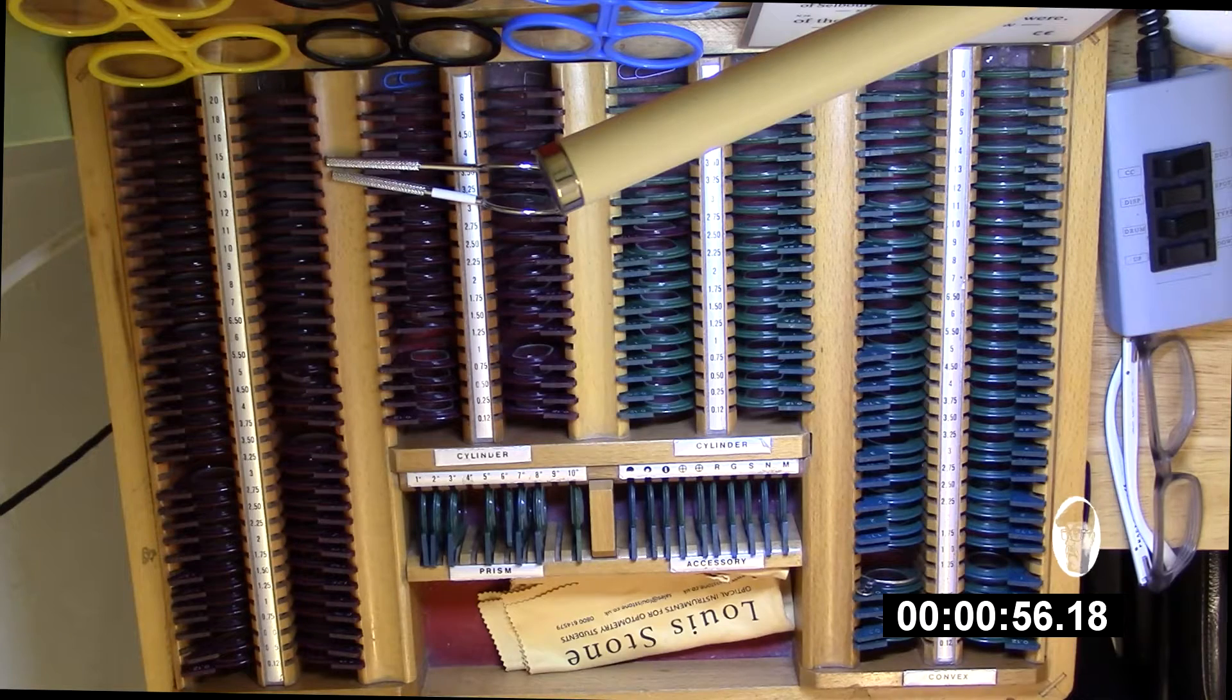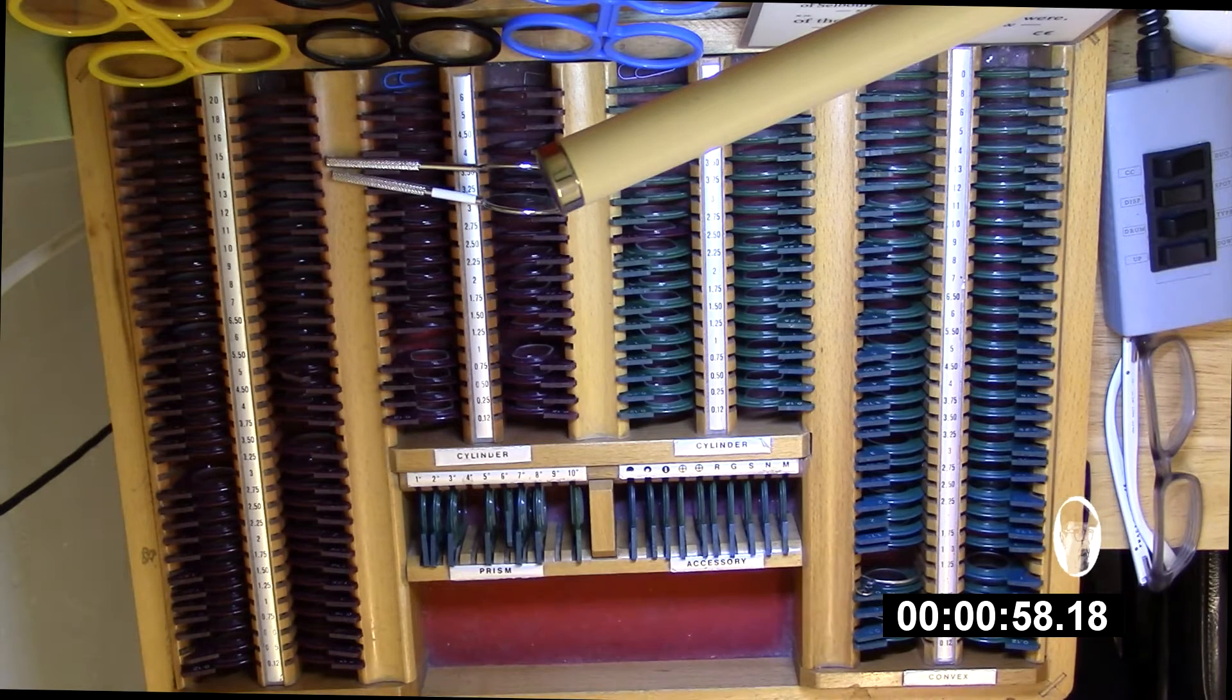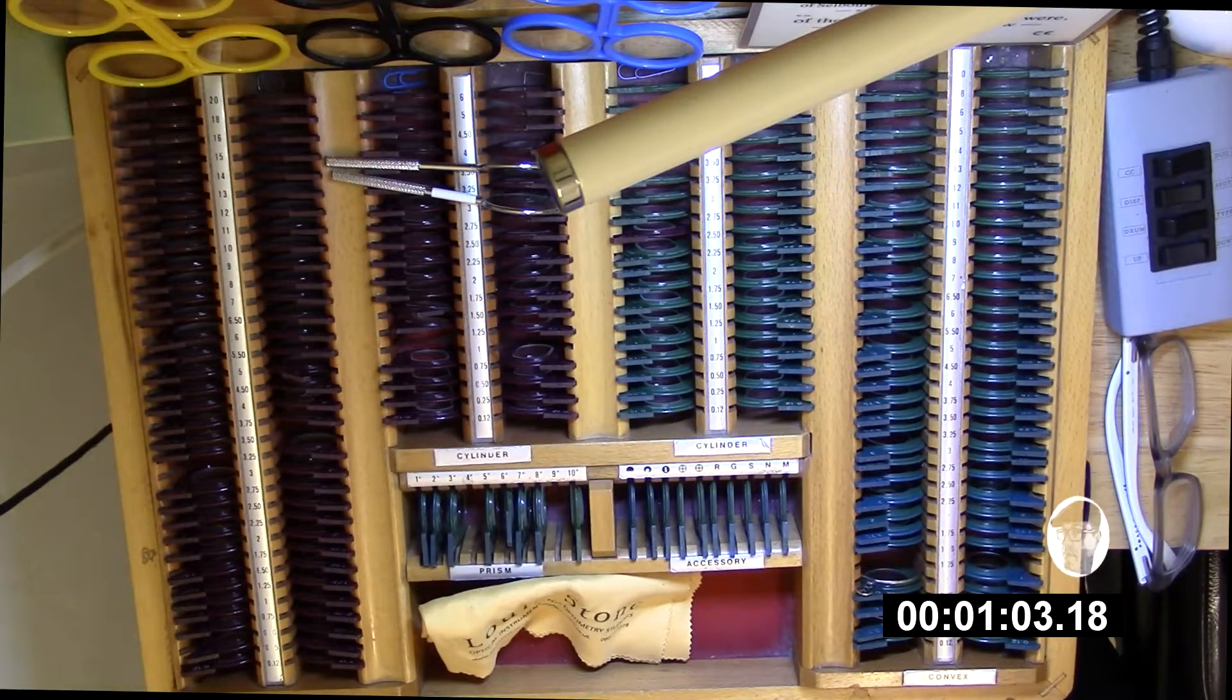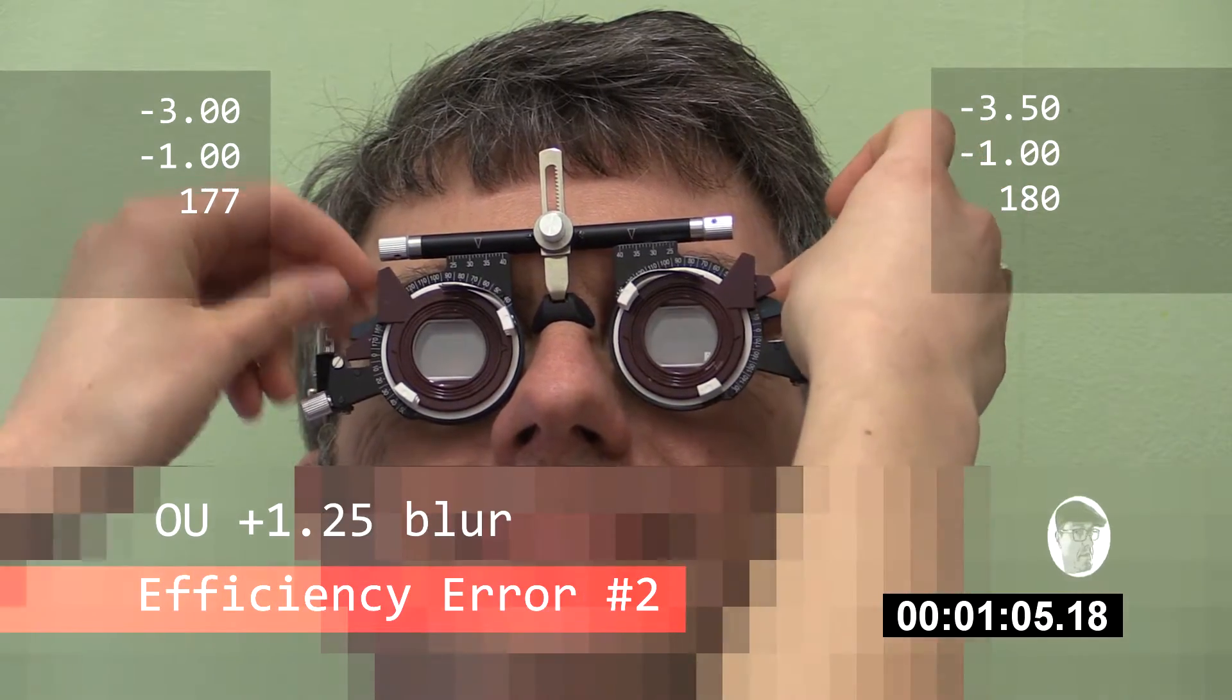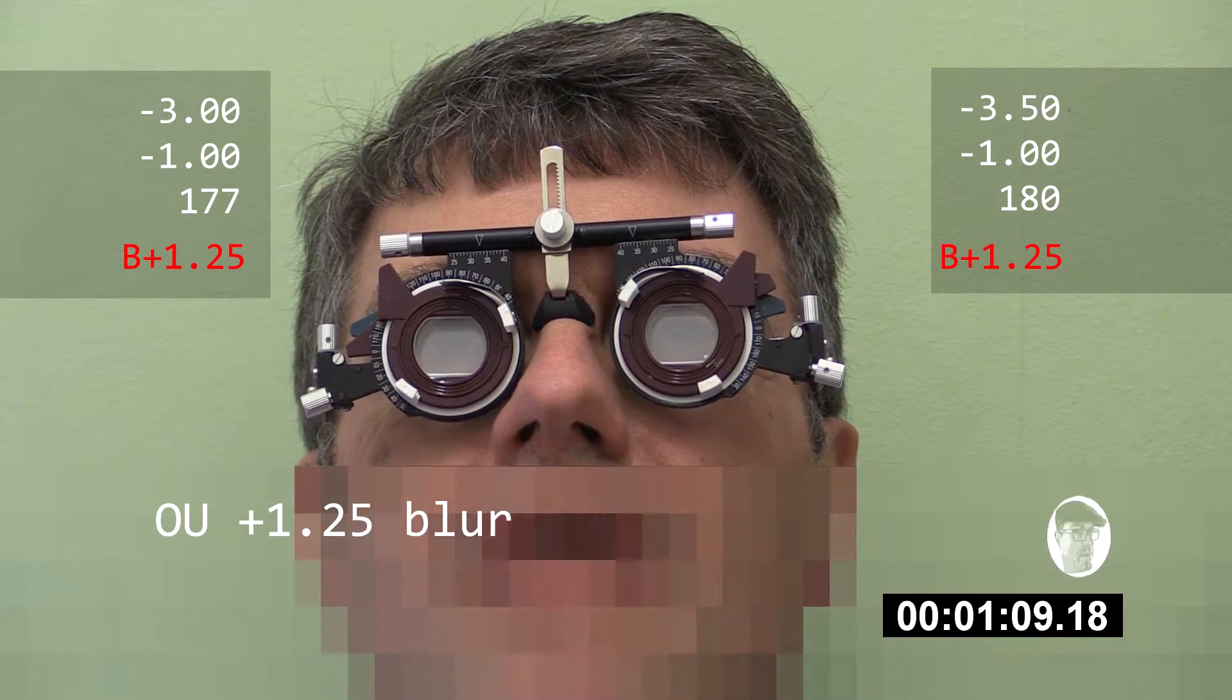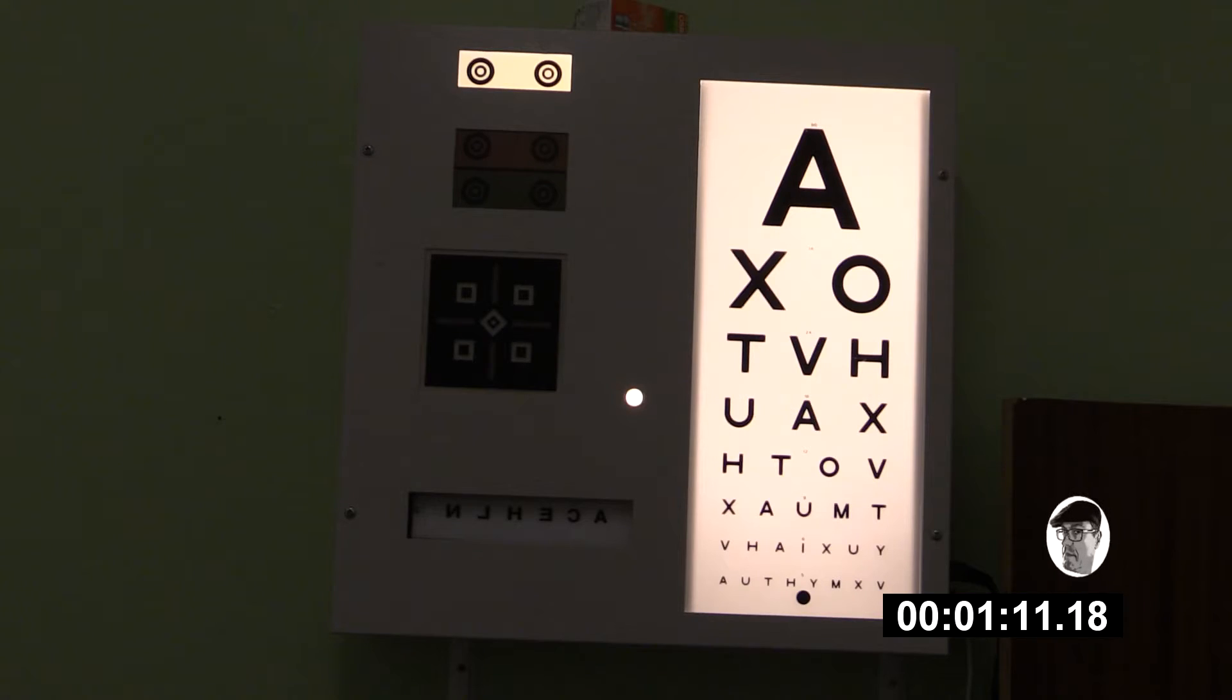And this time I'll attempt to do my binocular balance, so you can see the difference between the two. So we're going to pop those in place there. What's the smallest you can see now? Well, maybe V, O, T, H, maybe T, M, U, A, X, that's all.